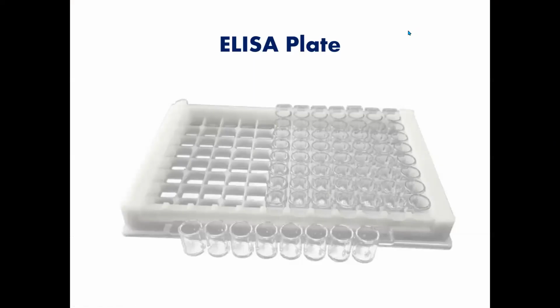Okay. So the next comment is on lateral flow assays. Are they the same as rapid detection antibody tests? Yes, for detecting antibodies and antigens, and even now some lateral or rapid detection kits for nucleic acids. Griffin is asking about the unbound anti-somethings, either antibodies or whatever. I don't understand that. Maybe he was responding to somebody.